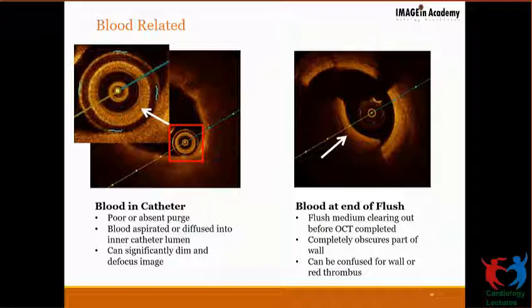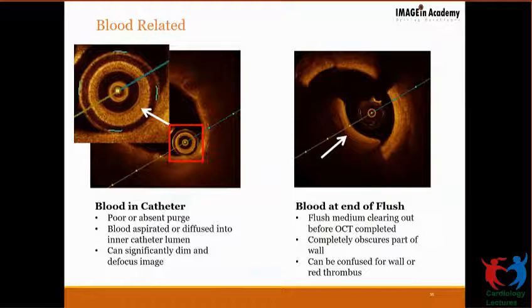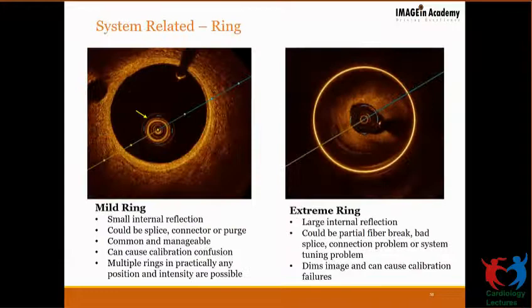Now you can have the system related rings, and you can have a mild ring. That means there is a small reflection, as you see here. Sorry, did I press? Okay, I went up instead of coming down. And this shows that the angle is not right.